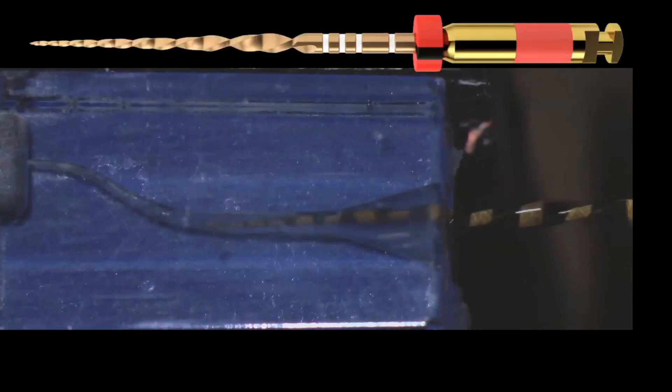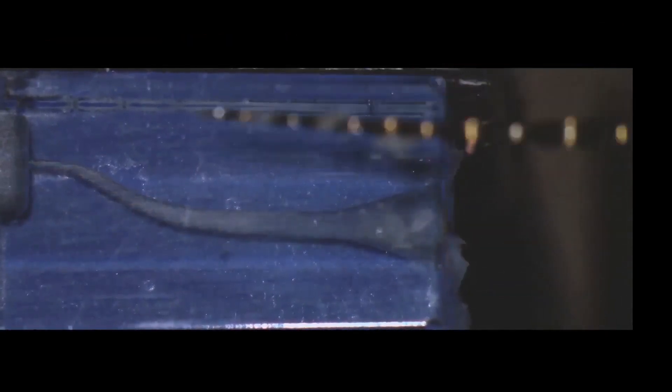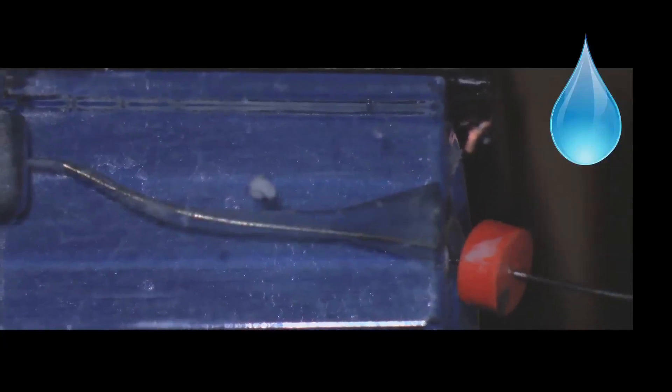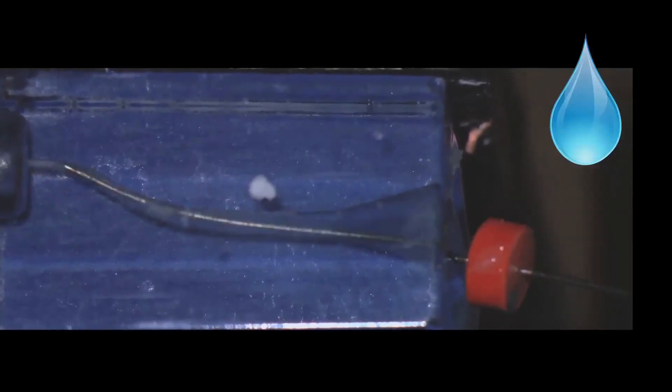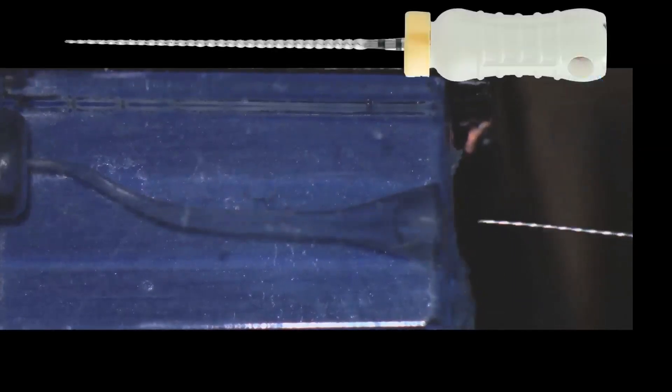Now we will go all the way to working length with WaveOne Gold. As soon as we achieve that length — when the rubber stop touches the reference point — we don't need to continue reciprocating inside the canal. You can see the efficiency of this file in cutting dentinal chips. We clean the instrument and irrigate with the needle as deep as we can. The needle must always be loose in the canal — it can never be lodged inside the canal. We irrigate and once again ascertain that we have not blocked ourselves with the very small instrument that established working length.